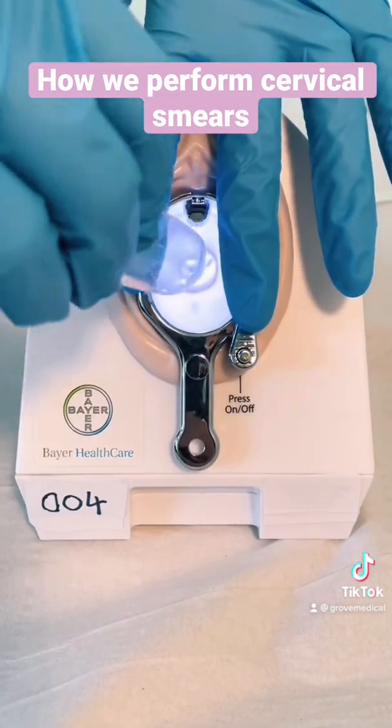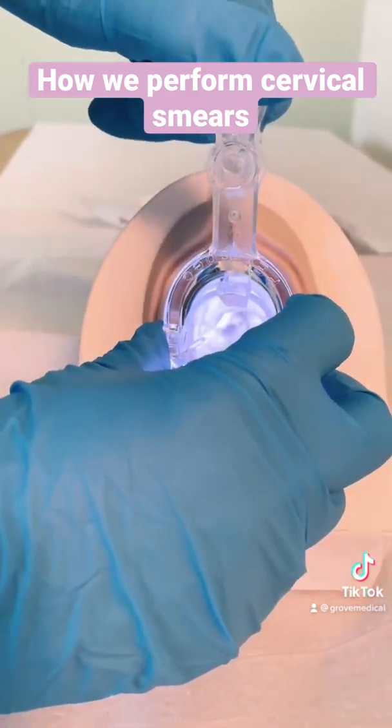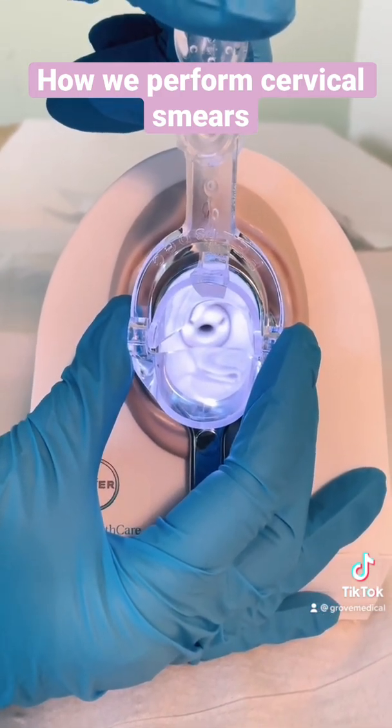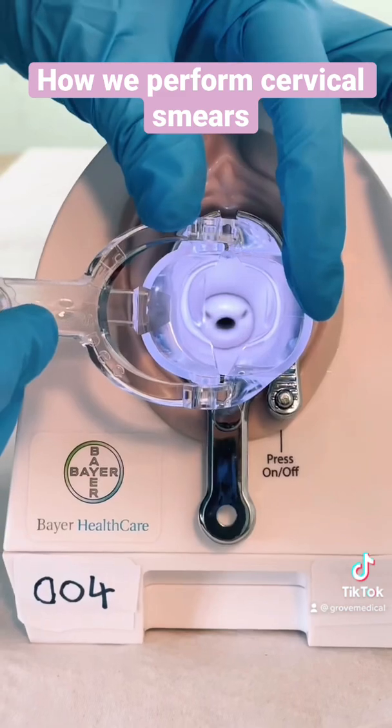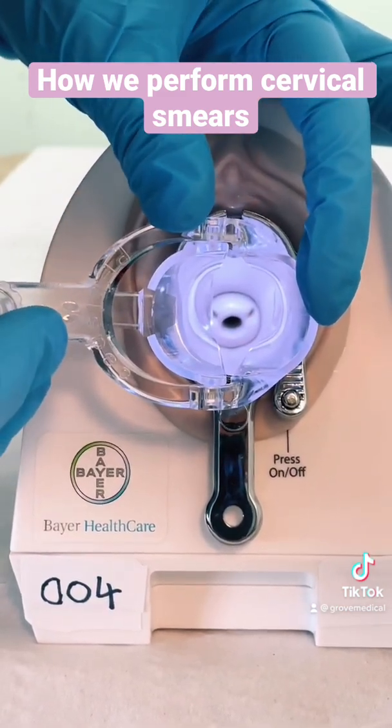Before I start, I let you know that the speculum is going in now. When I'm at about the right space, I begin to open it a little bit more, and I ask if you'd like me to stop at any point, I will do. From there I can get a good idea of whether this is a healthy cervix or if we've got anything to worry about.